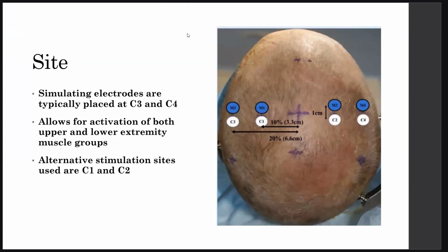Okay, the sites we said we'll mark like an EEG, like in any other EPs. It is better to implant your electrodes in all 4 points, even if the scope of operation was not both upper and lower. Why? Because C1, C2 are more liable to get your response from the lower limb. C1, C2 montage. And C3, C4 montage will stimulate the upper limb, which is logical because if we look at the map of the primary motor area, it is lower limb and then upper limb. And C5 lower down here will stimulate the area of the face.